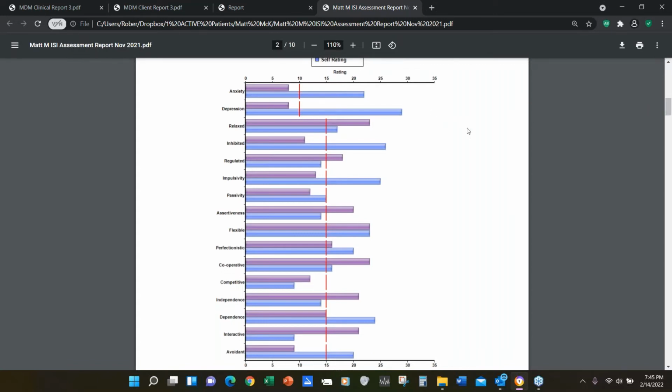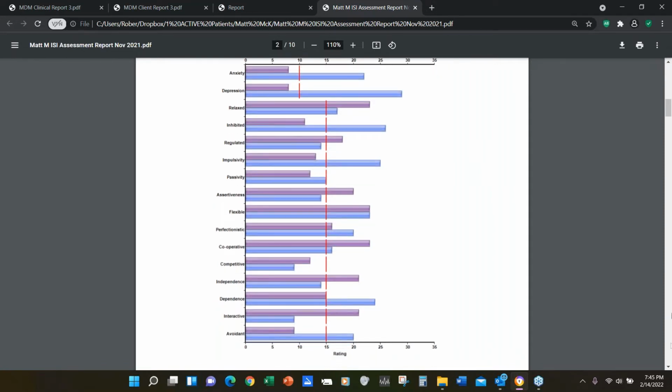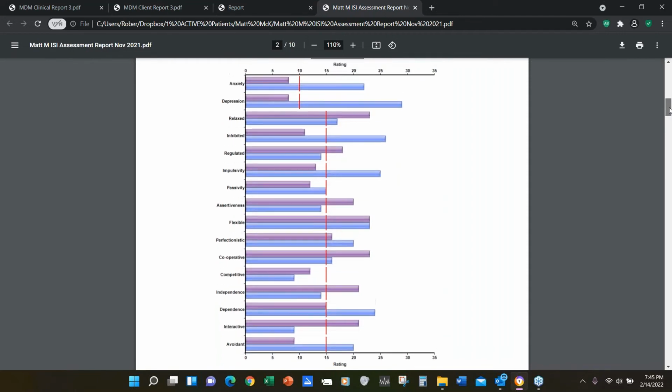Yeah, that would be really helpful for me to know. Great idea. I don't know why we never did it actually. I thought this was normed 16 and up. No, it's 18 and over. 18 and up? Okay. 18. Oh, right. And I guess I'm just thinking we just changed it. We used to do it. Yeah. Thank you for that, Judy. I couldn't remember how we did it. Rob uses it, and other people use it for younger people.